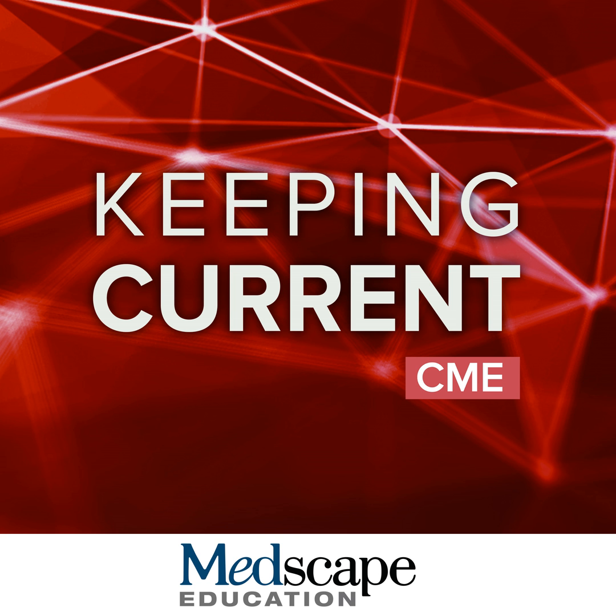And that is particularly in patients who may have a couple microhemorrhages on, let's say, an MRI exam 1 year prior. Those are cases where, for a more accurate risk assessment, it would be better to get an exam closer to the date.